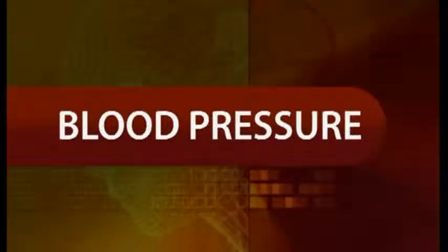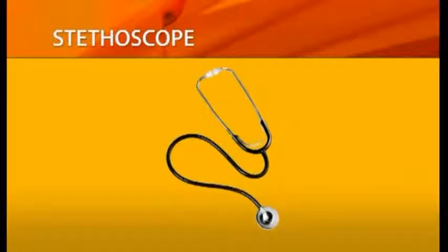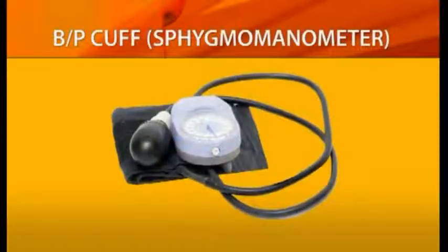The next vital sign reading we are going to discuss is blood pressure. You're going to need two tools to obtain this reading. One is a stethoscope, and the other is a blood pressure cuff, also called a sphygmomanometer.